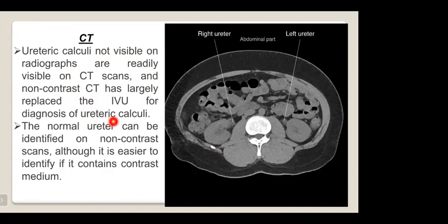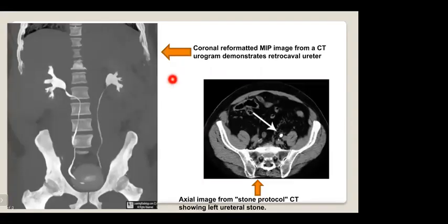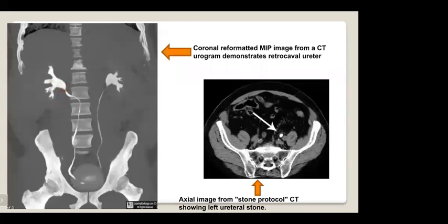The normal ureter can be identified on non-contrast CT although it is easier when containing contrast media. A coronal maximum intensity projection CT urogram can demonstrate a retrocaval ureter — a condition where the ureter courses behind the inferior vena cava, causing obstruction and dilatation of the proximal portion. Axial images from stone protocol CT can show a ureteric stone.